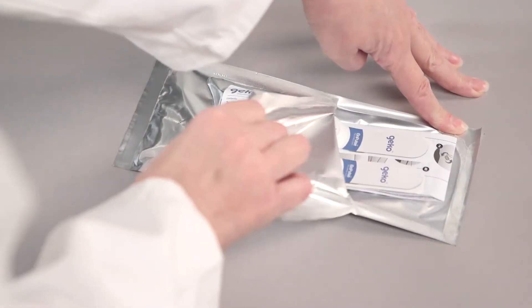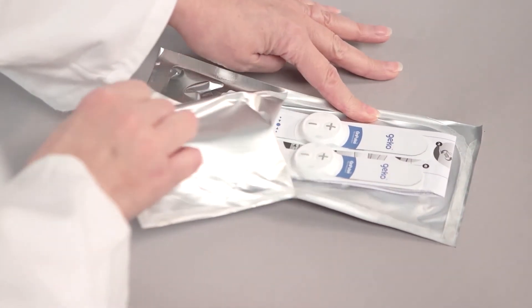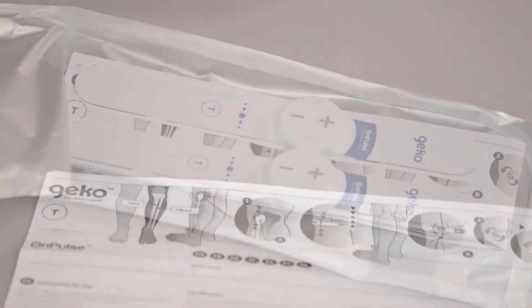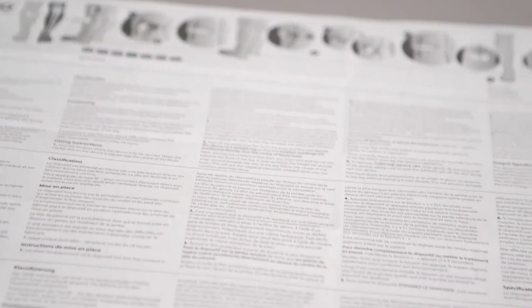To open the pack, simply peel the two ends of the foil pouch apart. Inside, you'll find the Gecko devices and an instruction leaflet. Read the instruction leaflet carefully to familiarise yourself with the warnings and precautions and only use the device as instructed.